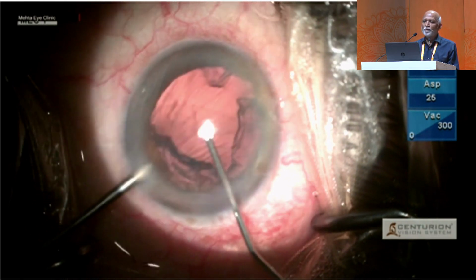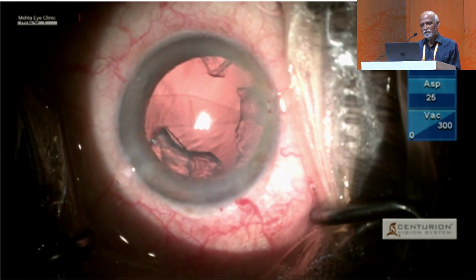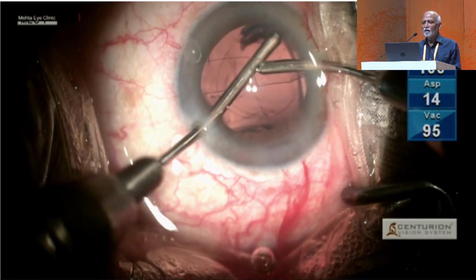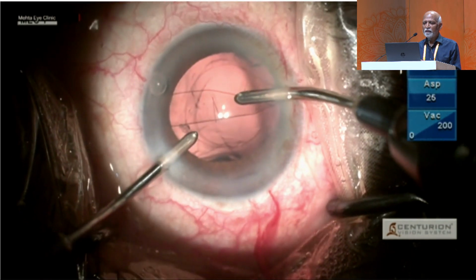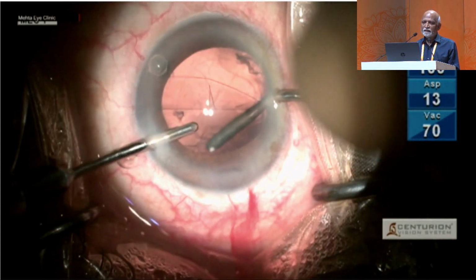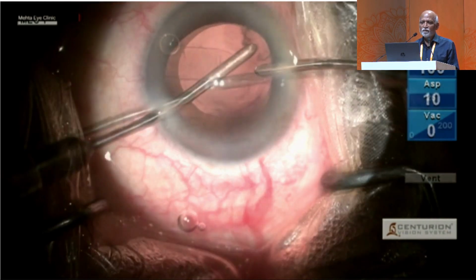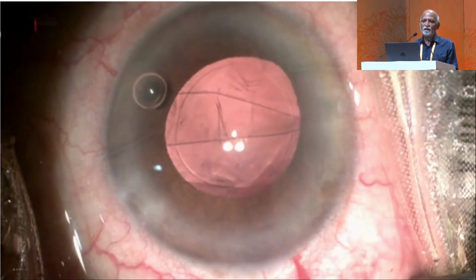So I had to put in some viscoelastic below it in the chamber, and I had some amount of cortex to be aspirated, which I did under the viscoelastic without disturbing the detached Descemet membrane. Once that was done, we had the issue of putting the IOL, and I thought that I'm going to put the IOL under saline and not under viscoelastic.